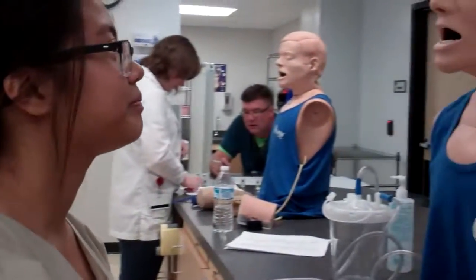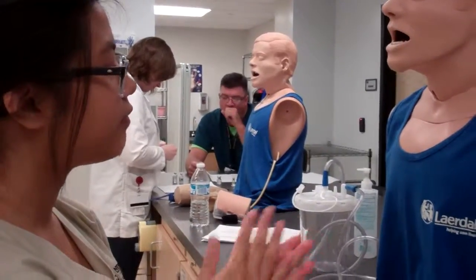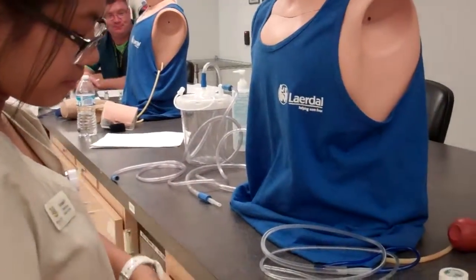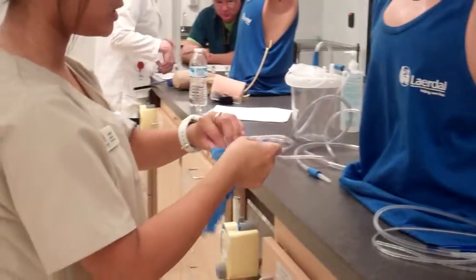Come in. Good morning, my name is Annabel and I'm a student nurse from Nevada State College. Can I have you verify your name for me, please? David Schumer. And your date of birth? 1/10/63. Okay, let me check your name band. Alright, everything seems to be checked.